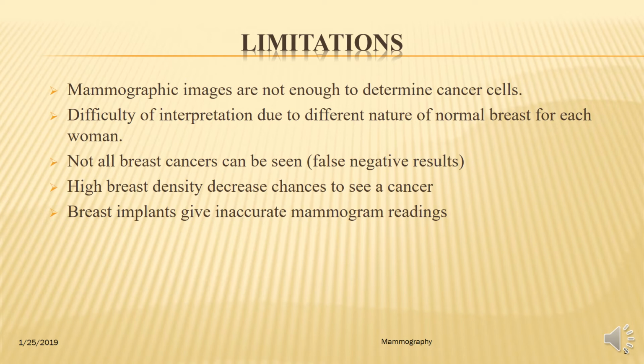Interpretations of mammograms can be difficult because a normal breast looks different for each woman. Also, the appearance of an image may be compromised if there is powder or salve on the breasts or if you have undergone breast surgery, because some breast cancers are hard to visualize. Radiologists may want to compare the image to views from previous examinations. It is very important to realize that not all breast cancers can be seen on mammography.